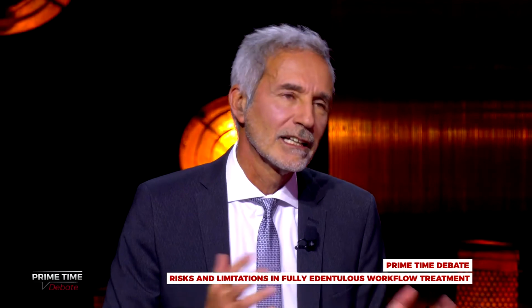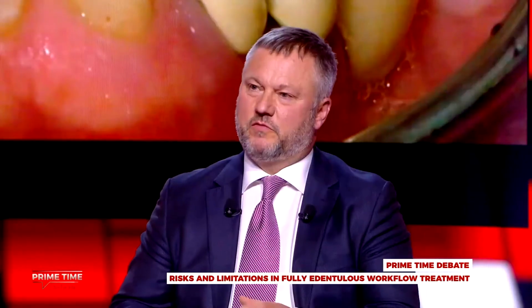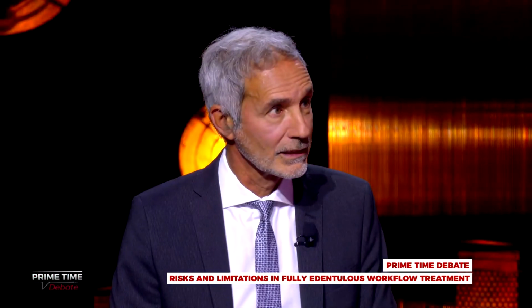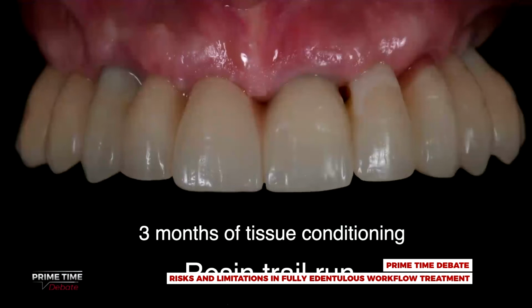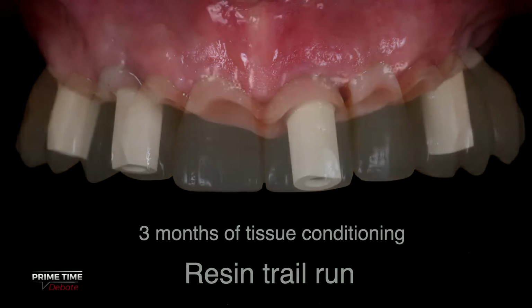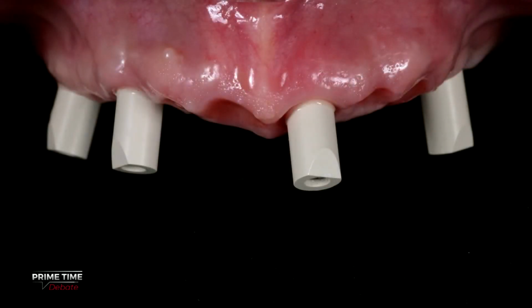Okay, so now you have the implant in position, you have immediate loading with the provisional bridge. Can you show us the next step, please? Yes. The next step is after the healing, the final impression. So we can go back to the initial question that was made in the Is It True session. The impression. It is possible to perform an optical impression in a full arch.